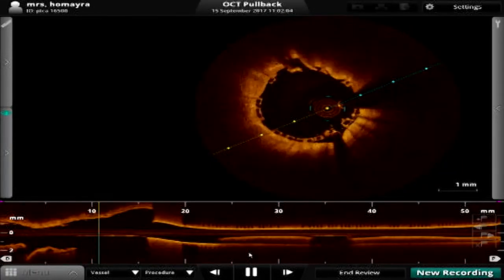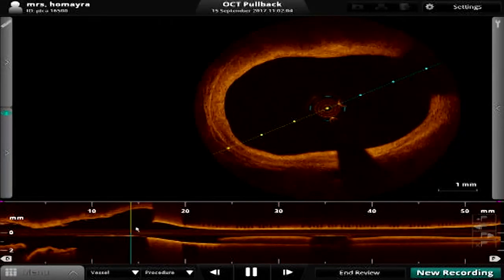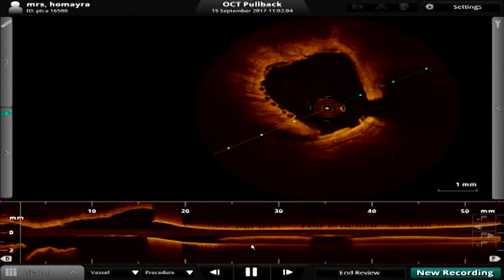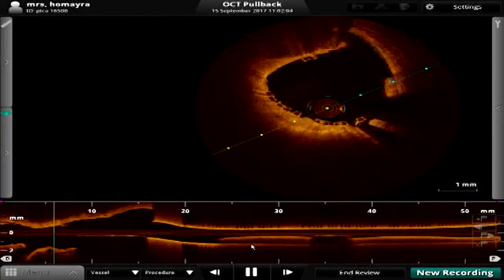So it looks very well, nicely expanded and very good apposition in the proximal segment. Can you show one run again, please? As well, I think you hit it right on the ostium with the LAD, so I congratulate you. Yes, side branch ostium.